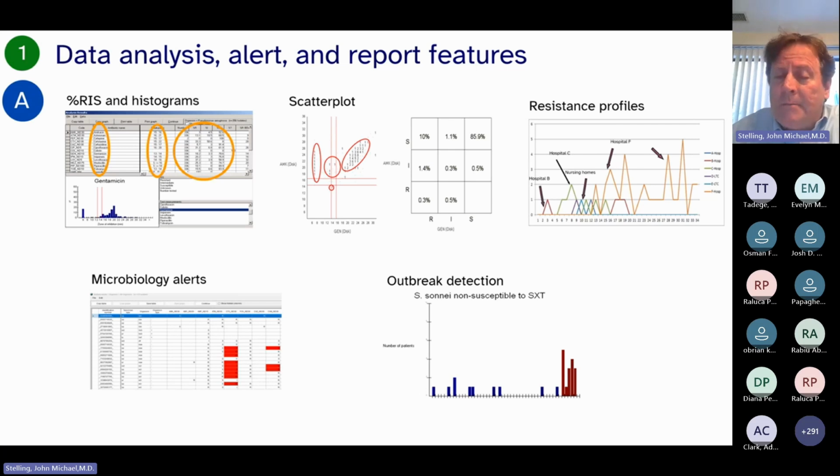So it's another example where we are using the resistance from the phenotypic perspective to say these look like the same bacteria. And I can see that this happens. These are, I believe, weekly data. I see that these data, Shigella sonnei, it happens once, zero, twice a month. So it happens. It doesn't happen very often.